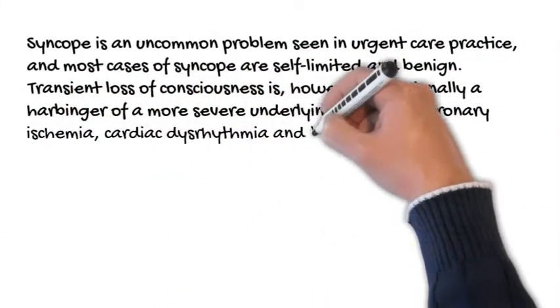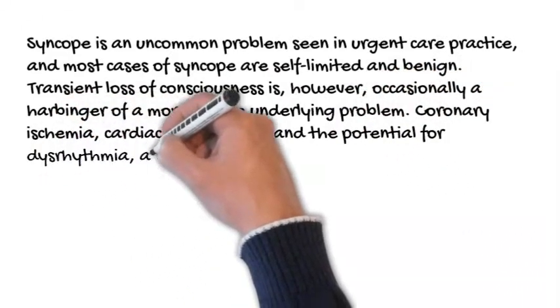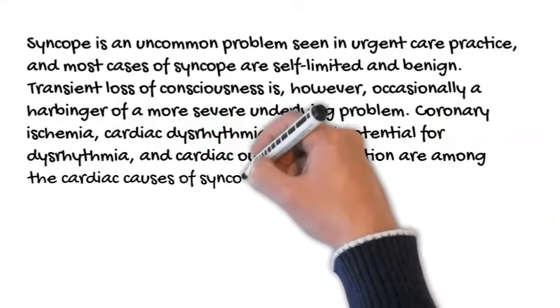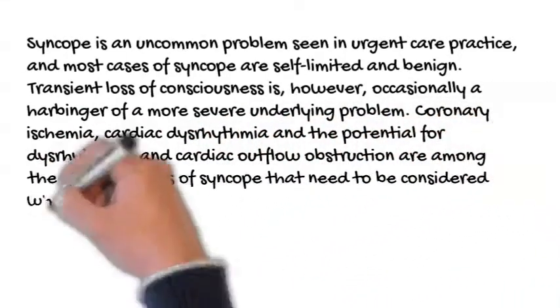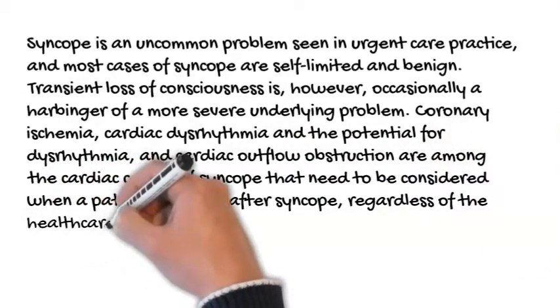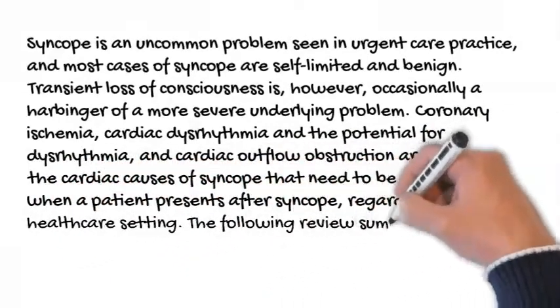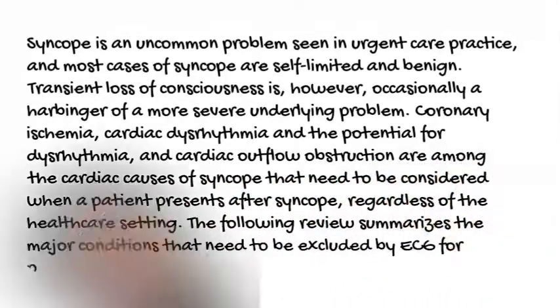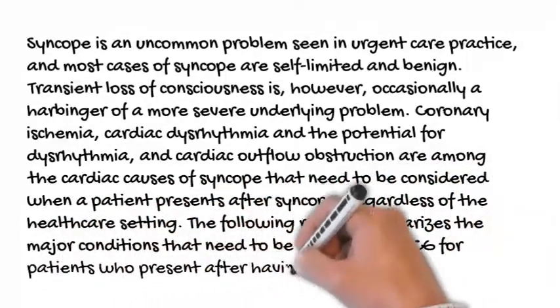Coronary ischemia, cardiac dysrhythmia and the potential for dysrhythmia, and cardiac outflow obstruction are among the cardiac causes of syncope that need to be considered when a patient presents after syncope, regardless of the healthcare setting. The following review summarizes the major conditions that need to be excluded by ECG for patients who present after having passed out.